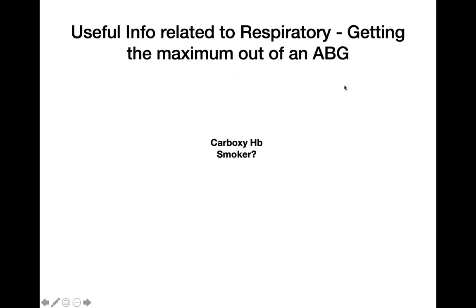And we talked about this a bit earlier, getting the most out of your ABG. I always check if it gives you the carboxyhemoglobin, and this can let you know if they're smoking, particularly if you're trying to get an accurate smoking history. Hopefully we're all making patients feel like they can share what they're smoking, but check that this corresponds to what they're saying, whether they do need more support to stop, or whether it's not an environment where they feel that they can share that.